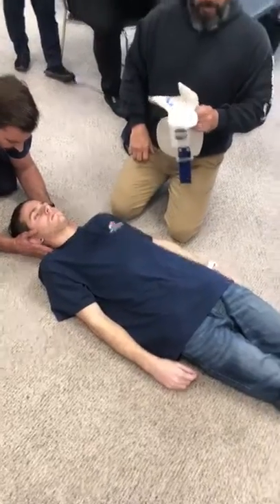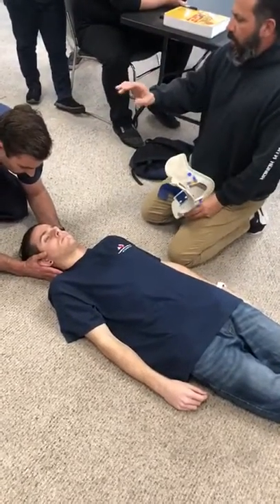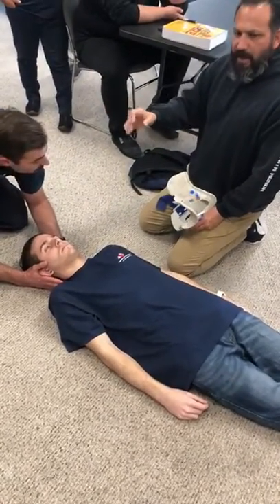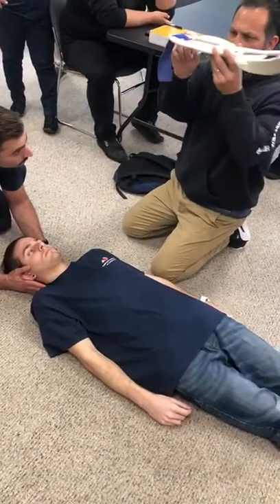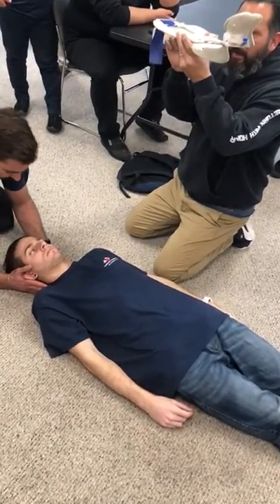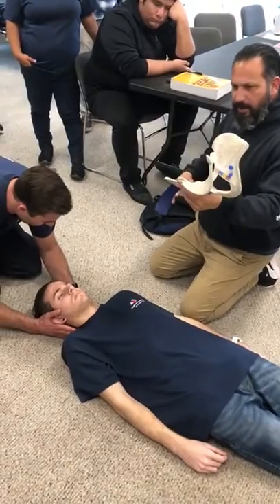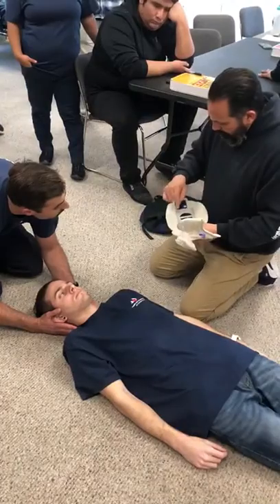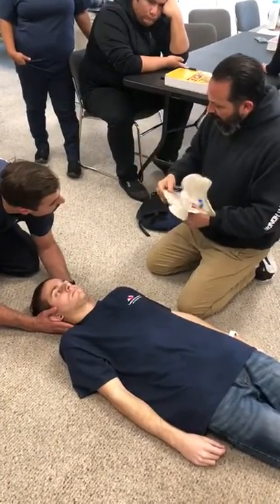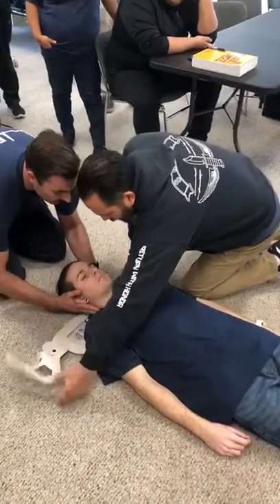This is where you have to work in coordination with your partner. He's going to have to lift the head slightly — just high enough for me to get the collar underneath the patient's head. We're not lifting his head dramatically, just slightly so I can slide this underneath. We're going to lift on three — on your count. One, two, three.